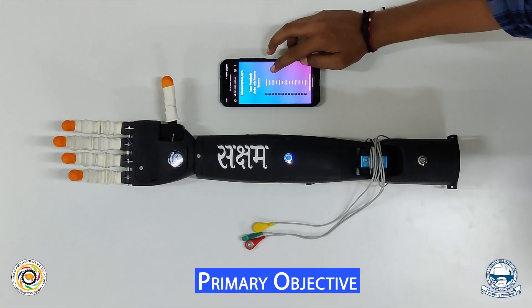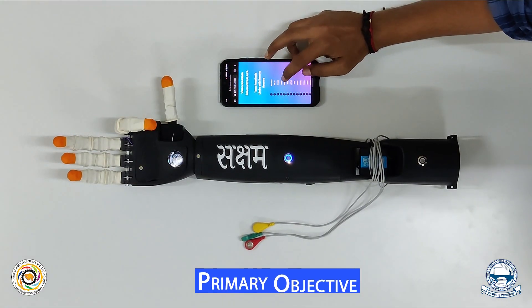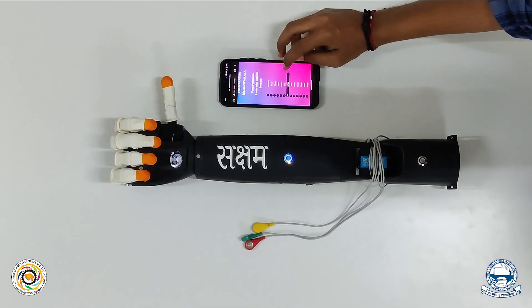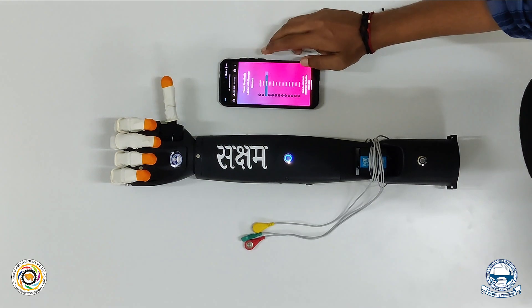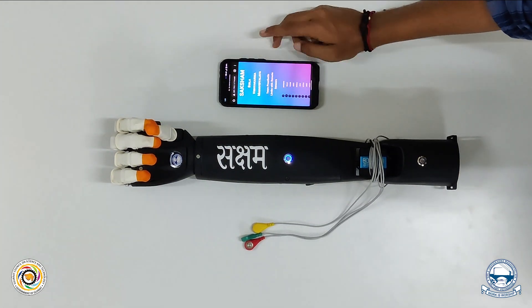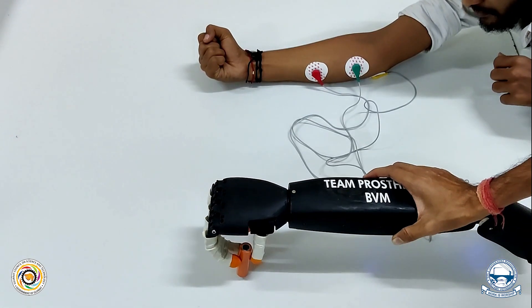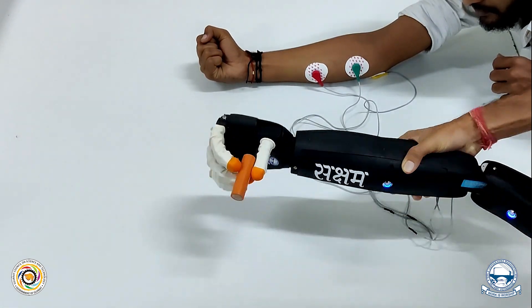As per Guchko's Robofest 2.0 guidelines, the primary objective in the category of prosthetic limbs with remote sensors is Forehand, which demonstrates independently actuating four fingers and a thumb, the ability to pick at least two different objects with at least two repetitions, and no ready-made kits or cases are allowed.